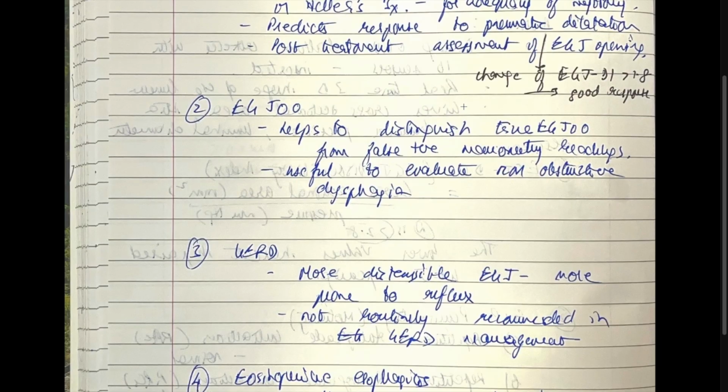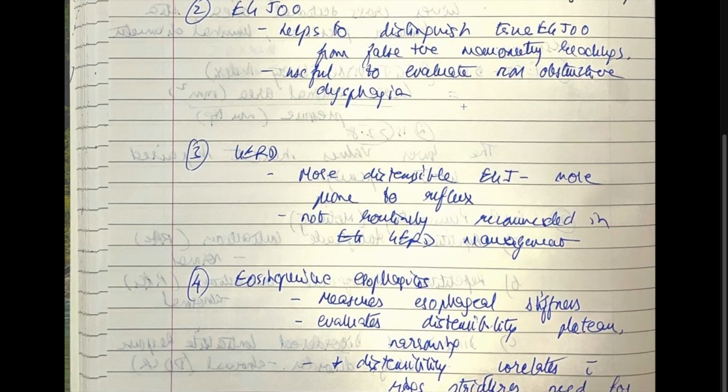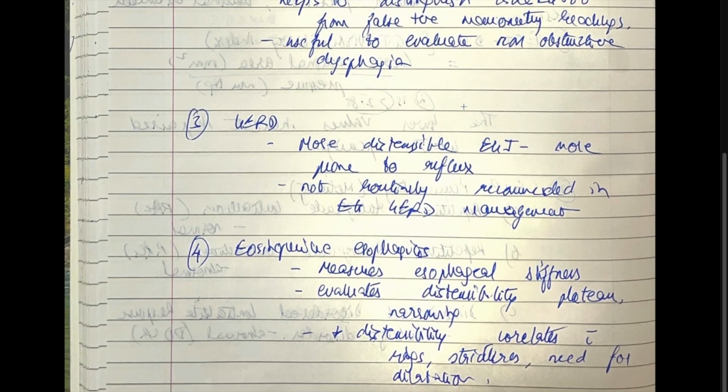And it's useful to evaluate non-obstructive dysphagia. In GERD, more distensibility EGJ, more prone to reflux. It's not routinely recommended in GERD management. Eosinophilic esophagitis, it measures esophageal stiffness and it evaluates distensibility plateau and the narrowing. And there's decreased distensibility and correlates with rings, strictures, and a need for dilatation.